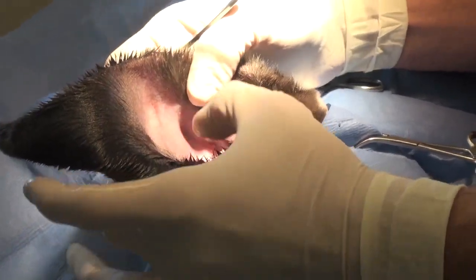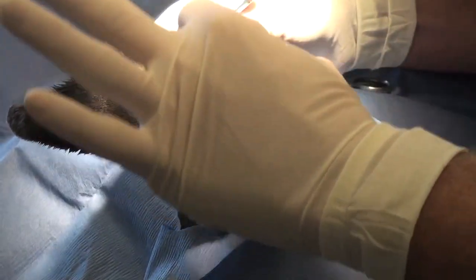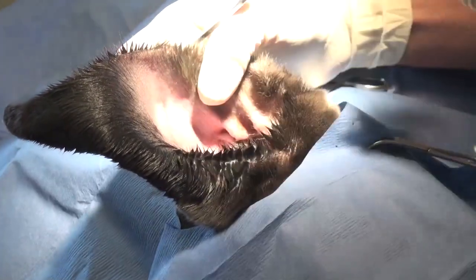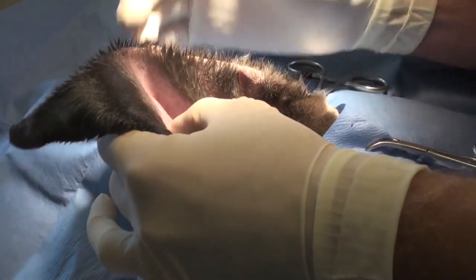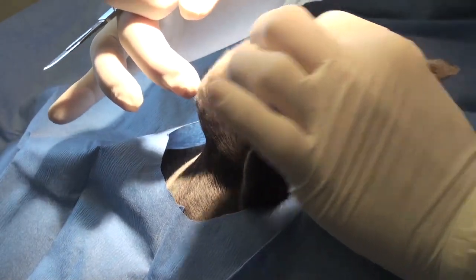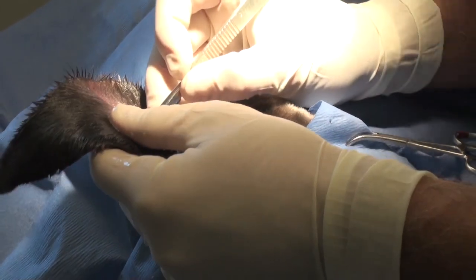There are several implants to fix this problem. The German option has a stainless steel implant — the insertion of that implant is different, and we do that too. But the owner of this dog wanted the nauticals. So in this particular situation, the implant goes through the cartilage to place in the back. I'll show you how it's done.